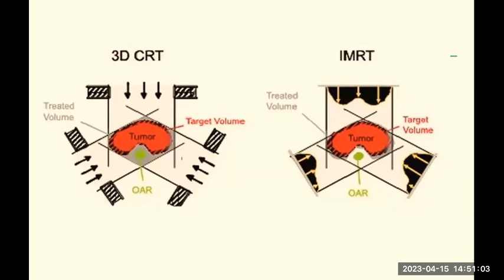When you go to IMRT, you can find that the beams entering at different places are completely different. In the 3 directions, the radiation beam arrow marks are different. At the top it looks like a sine wave, while at the other 2 places there is an increase in the beam and then it reduces.